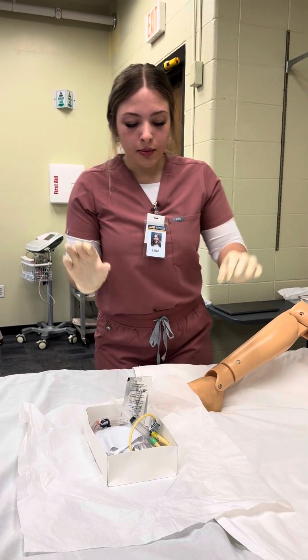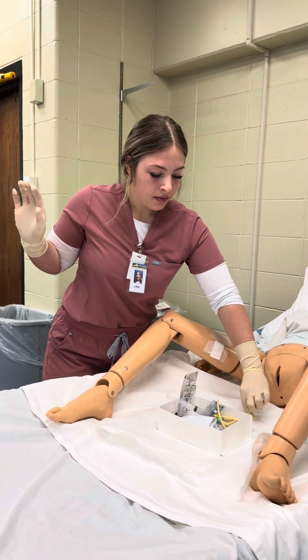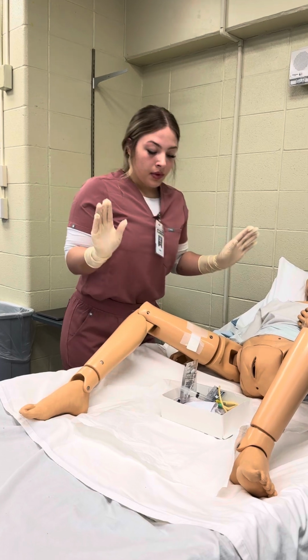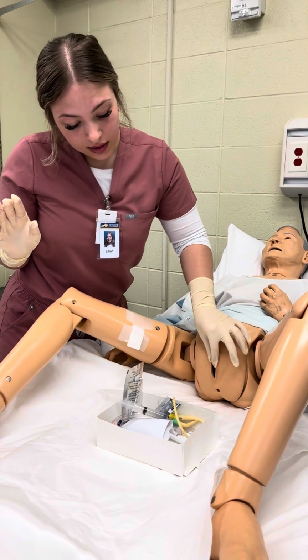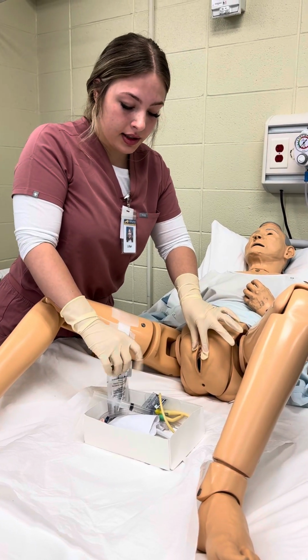And I'm going to move my box back to my working area and scooting it closer. And so next I'm going to use my non-dominant hand and open the labia to expose the meatus. I'm going to get my cleansing swabs.